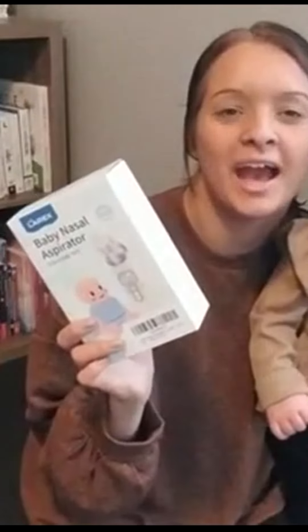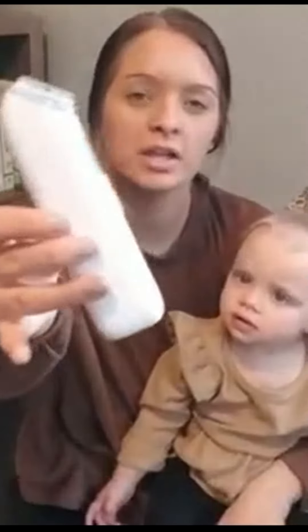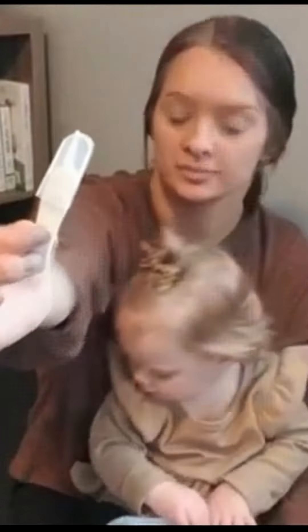Today from Amazon we have a baby nasal aspirator. Let's open it up — you also get a manual inside, and it comes in a nice little fancy box. Inside you'll find the main body part, a storage bin, a collapsible cup, three different nozzles, a charging port, a little clip, and a cover as well.